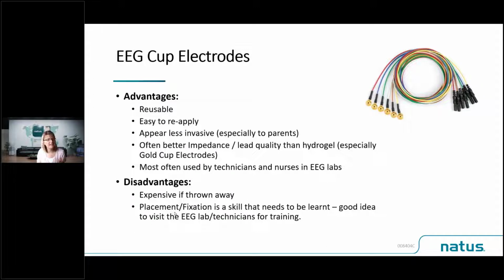You know, placement and fixation, it's a skill, but honestly, it's a skill that's very easy to learn. And sometimes it's a good idea just to spend some time with the EEG techs and shadow them maybe for half a day and watch how they actually apply and prepare for EEG cup electrodes. So great idea to visit the EEG lab and technicians for training.